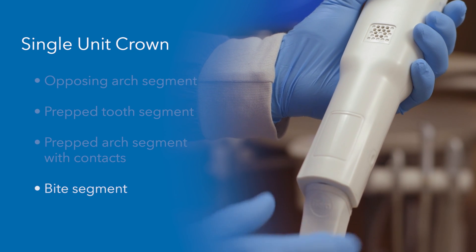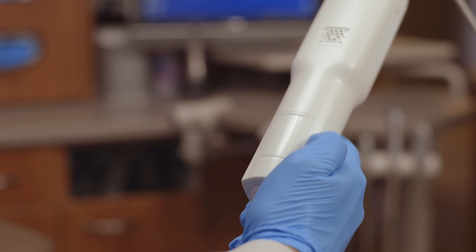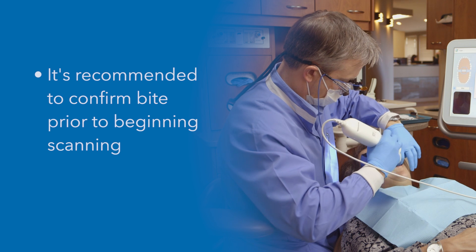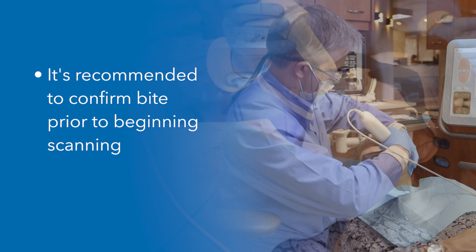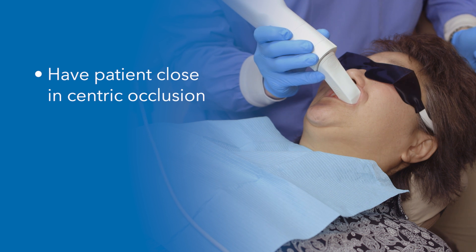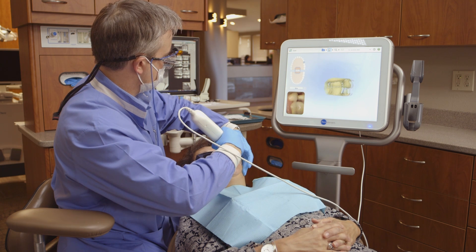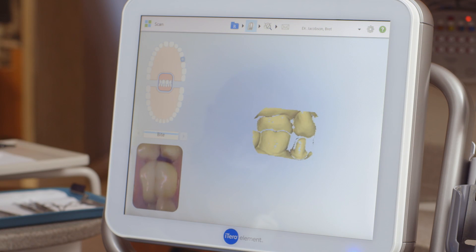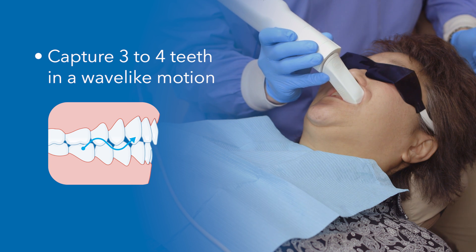The final segment is the bite. I will press and release both wand side buttons simultaneously and swipe on the touchpad from left to right to move to the bite segment. It's recommended to confirm the bite prior to beginning scanning. When I'm ready to begin scanning, I'll have the patient open, use the wand to retract the cheek, and have the patient close in centric occlusion. I'll be sure that I'm scanning in an area that has already been captured. Here, I'll bring the wand tip gently against the teeth, observing the occlusion in the viewfinder. Moving forward in a wave-like motion, I'll capture three to four teeth.